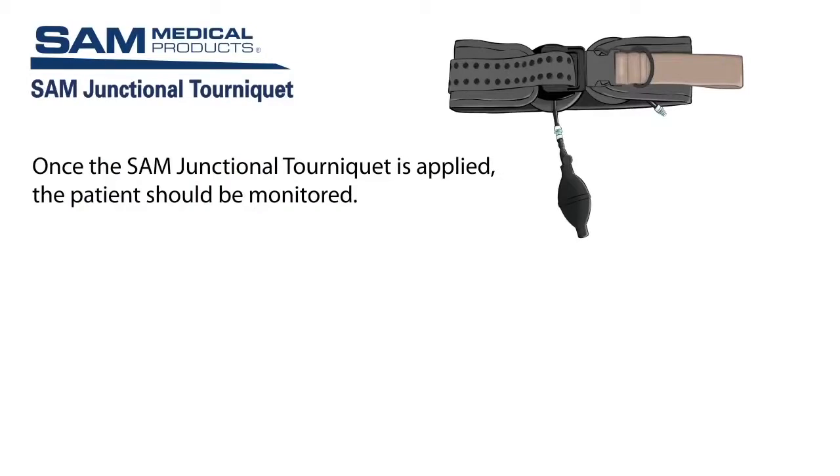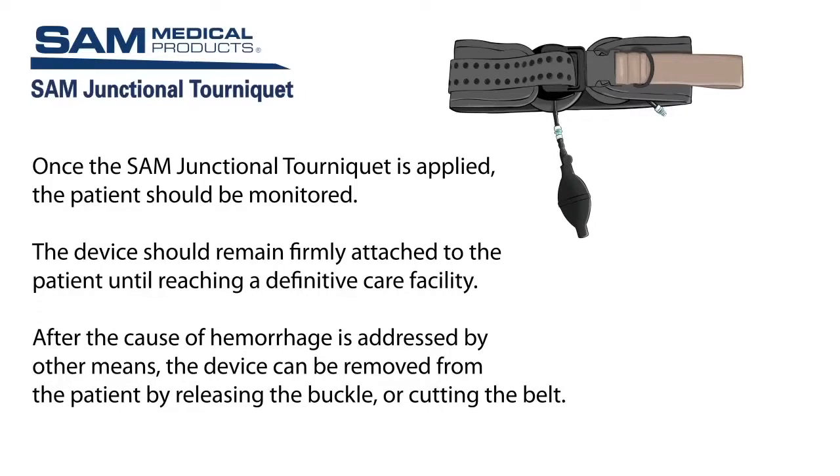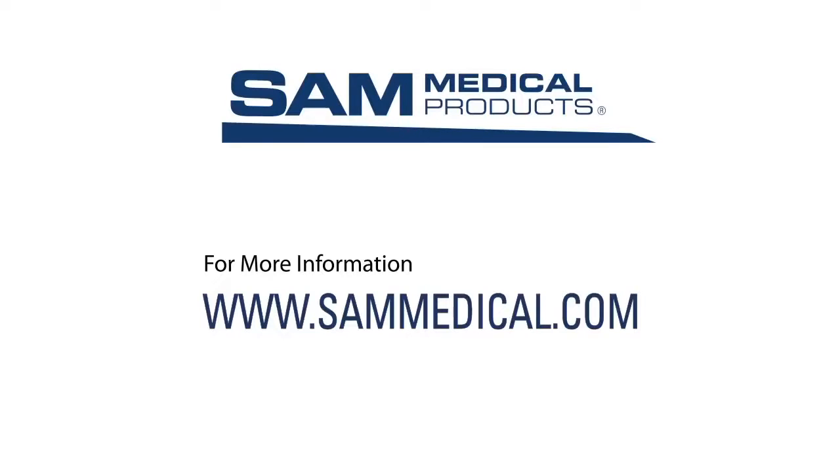Once the SAM Junctional Tourniquet is applied, the patient should be monitored as per your hemorrhage treatment protocol, and the device should remain firmly attached to the patient until reaching a definitive care facility. After the cause of hemorrhage is addressed by other means, the device can be removed from the patient by releasing the buckle or cutting the belt. To learn more, visit sammedical.com.